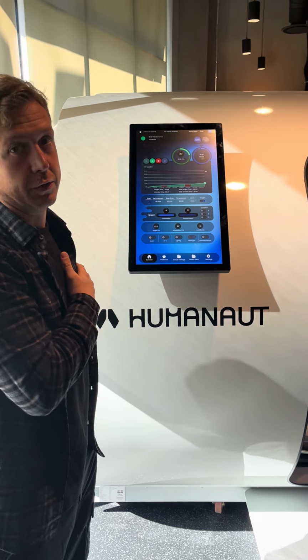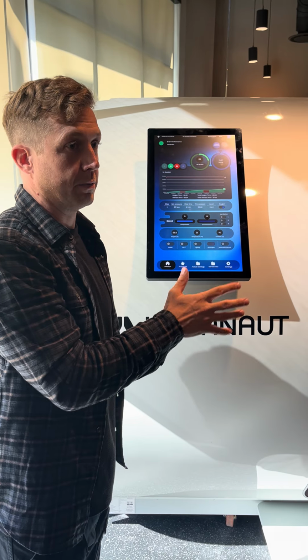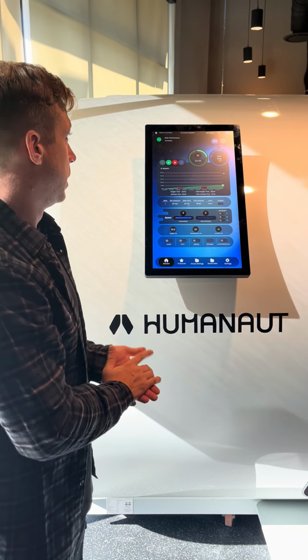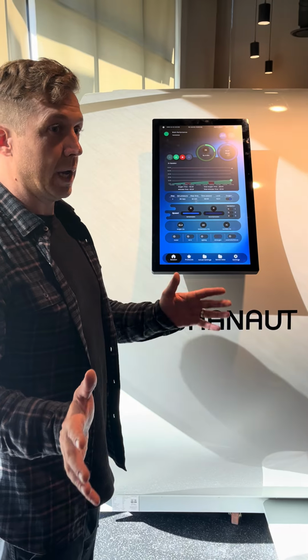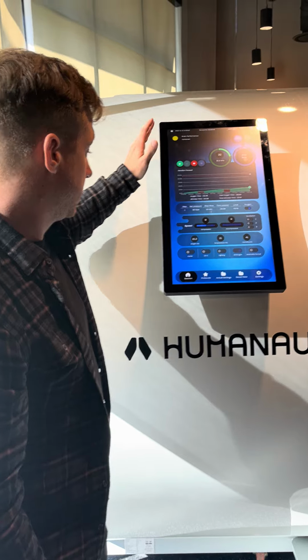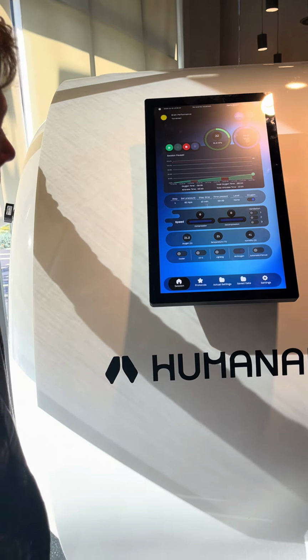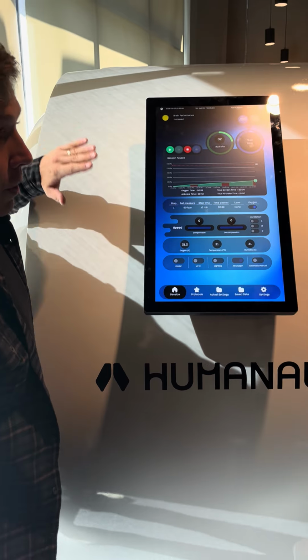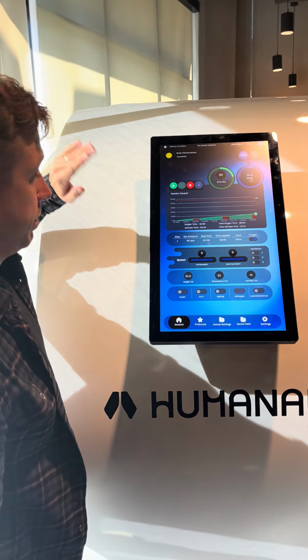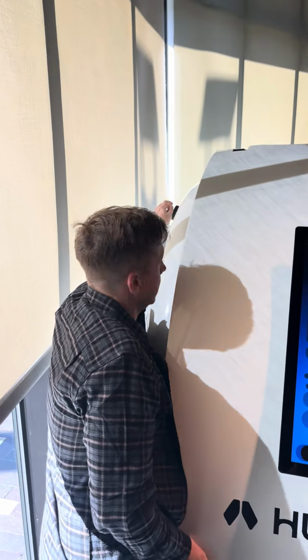I think that's it for chamber operations. Okay, so we'll go over, let's just say that, hey, I want to come out early. We'll go ahead and pause. All right. We'll pause you, and then I'm going to decompress you with a manual valve. Please don't hit the emergency stop. Okay, we'll come over here.